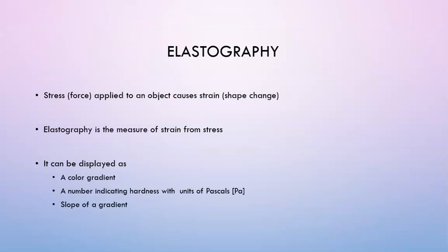Alright, so elastography is based on the principle that when we apply a force, it causes an object to change shape, or what we call strain. So stress, the force applied to an object, causes strain, the change of the object's shape. We're familiar with this with the piezoelectric effect, where we apply a force of electricity to a crystal, and this causes the crystal to change shape. In elastography, the force that we're applying is pressure, and we're measuring the strain, the change in shape, with various tools. So we'll talk about those tools in just a bit.